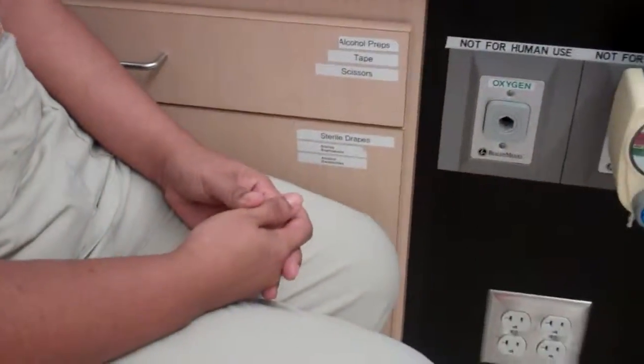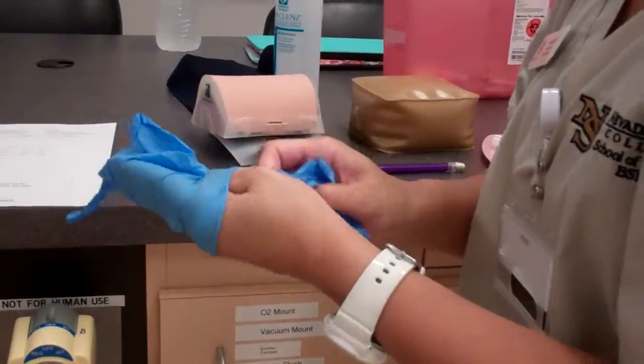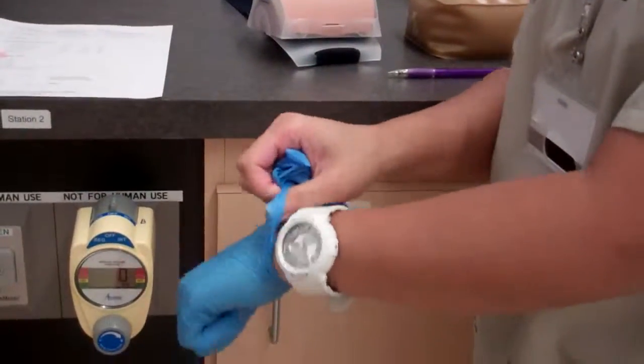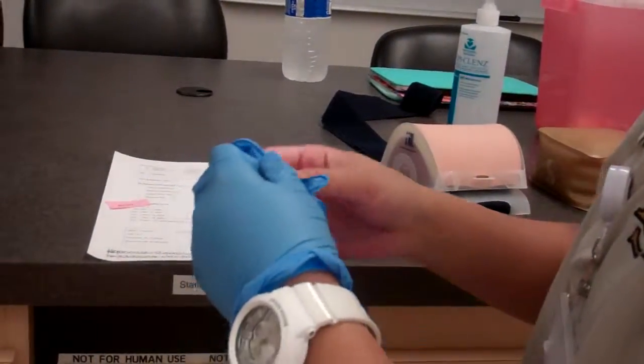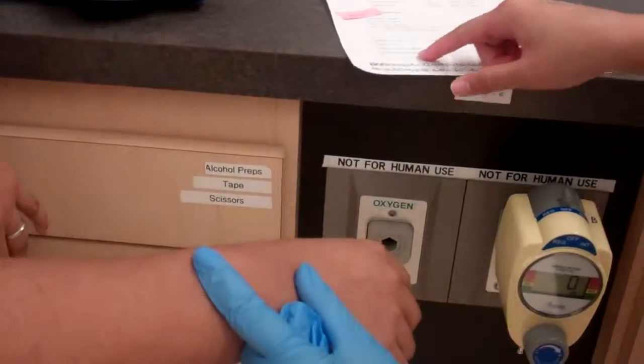So today I'll be administering your medications. You will be having NPH insulin and regular insulin mixed together. Your blood glucose was 323, so it's going to help level out. Oh, can I also just check your band just to make sure that you are the right patient? Okay, thank you.